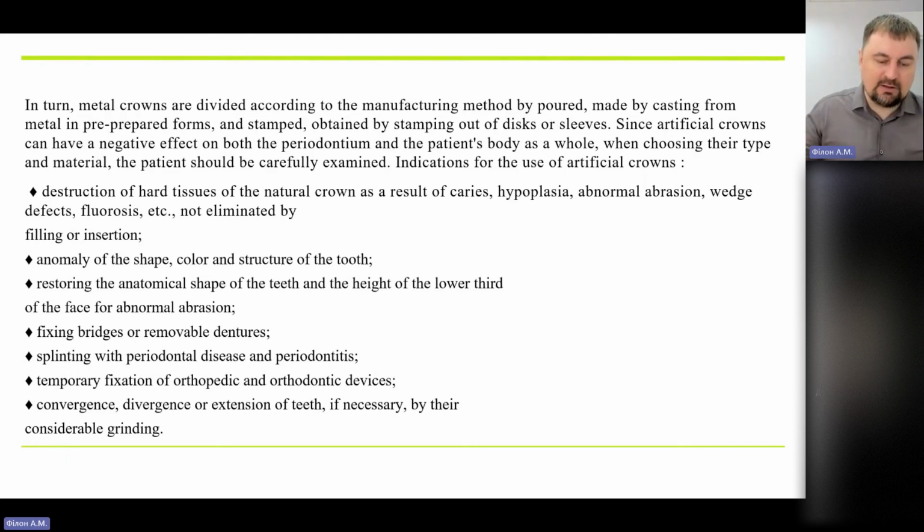plus X-ray examination methods plus photo protocol plus, if you have it in your clinic, a face scan, and only after that you have to prepare for the preparation of the teeth. Only after that.